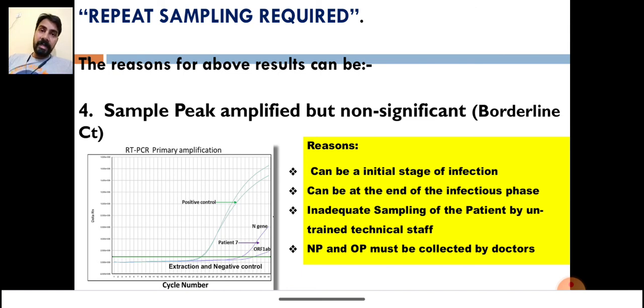We have to give by default repeat sampling required. In any of these four reasons, if in future you get the result from any COVID lab as repeat sampling required, then without wasting much time, just go to the collection center again and give your fresh sample for COVID RT-PCR.